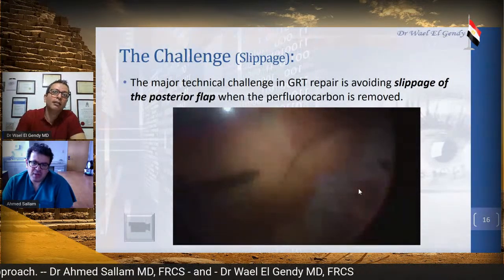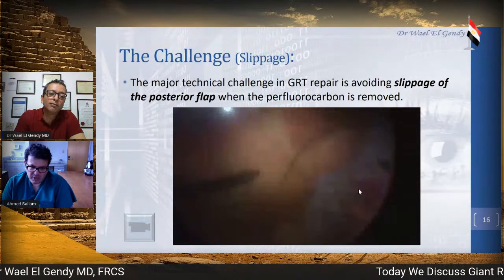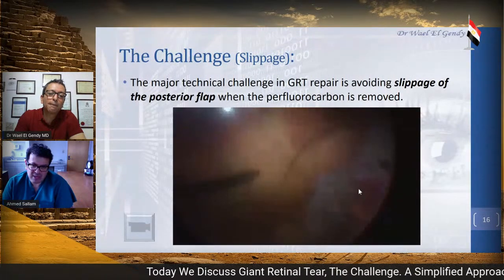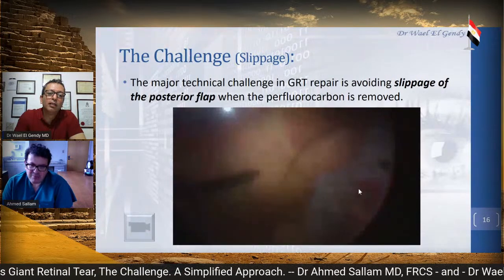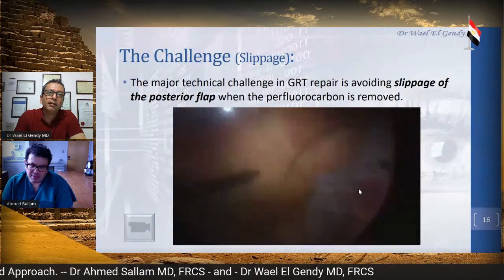I think it's like cryo. If one edge is touched with the cryo, it's fine. If you just touch only the RPE, the retina will stick. And I feel you've done several rows of laser. So yes, some rows might not be touching down, but the others would be.